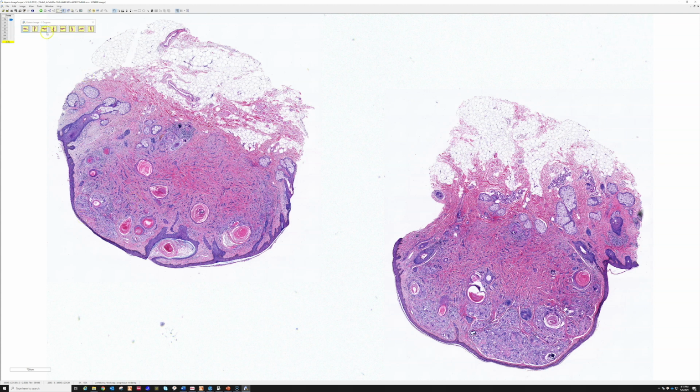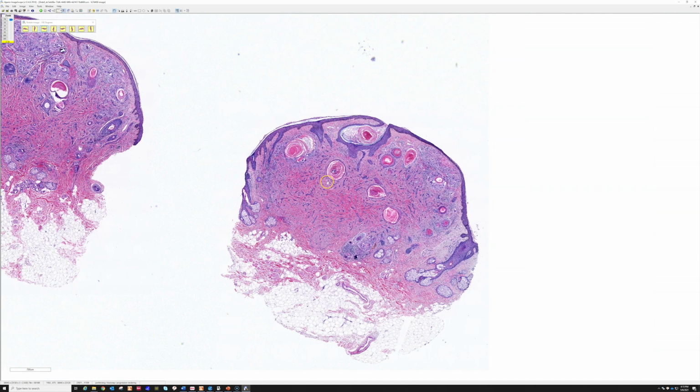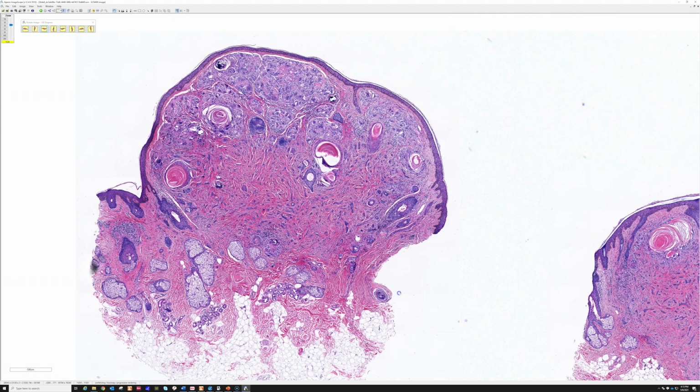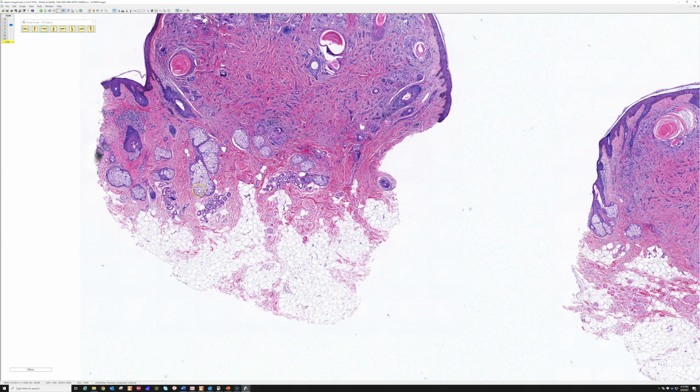Here we have a 25-year-old woman, and this is a firm nodule on the cheek. Actually, probably it was a papule, but I think I wrote it down wrong and said nodule. But it's a firm bump on the cheek, okay? And thankfully, someone took a nice large punch and punched the whole lesion out, which allows us to see not only the periphery but also the base.